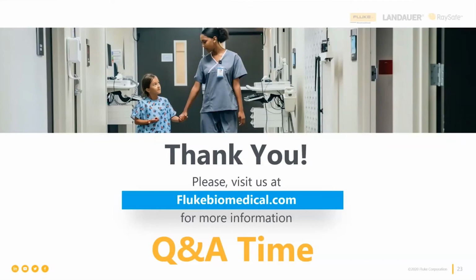The 84,000 incidents of defibrillator failure, a lot of which are AEDs, are saying, sorry, I don't care what the manufacturer says or what their firmware does, it's not enough. So I'm sorry, no, it's not enough. You can't just look at the little red light or whatever color it is and say, oh yeah, that one's okay.